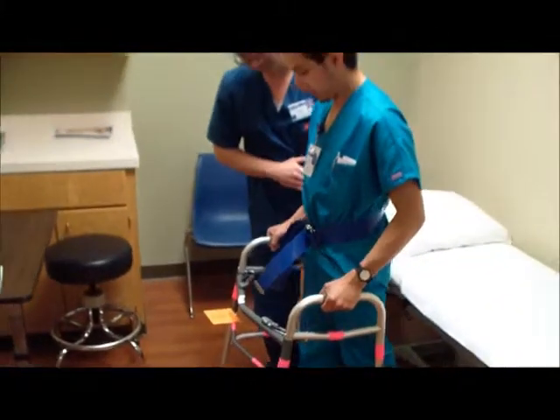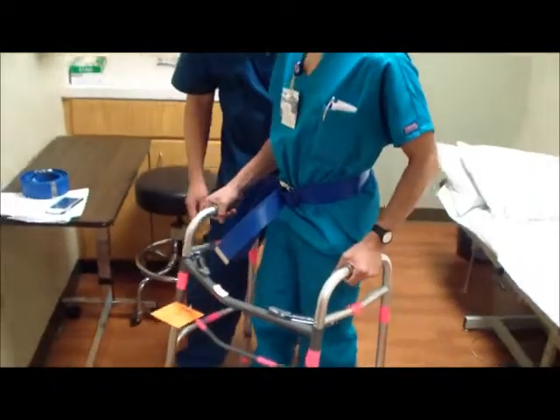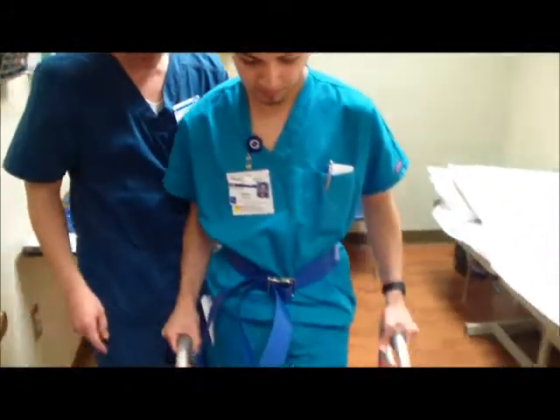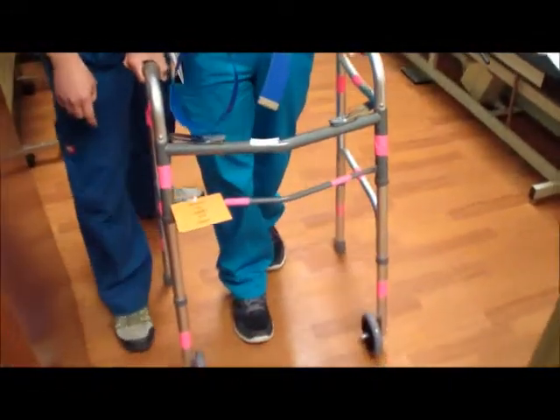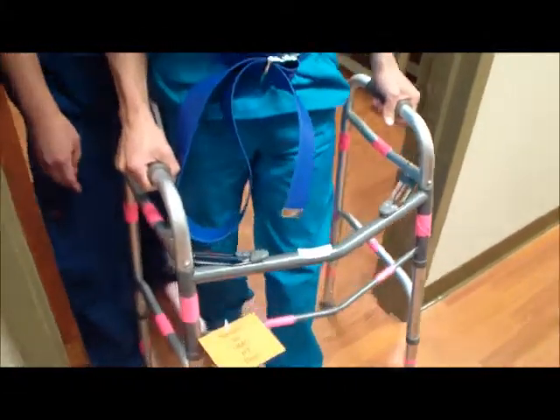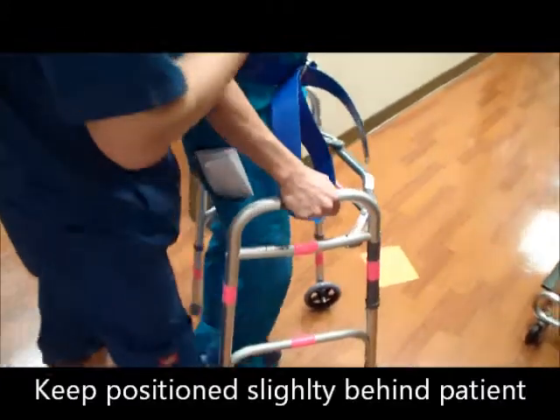Can you keep your elbows close to your body? Now let's make a turn here to the left. Keep yourself inside the walker, okay? And see how when I move my feet, I try to move in tandem, one leg at a time, and I keep myself towards his back.